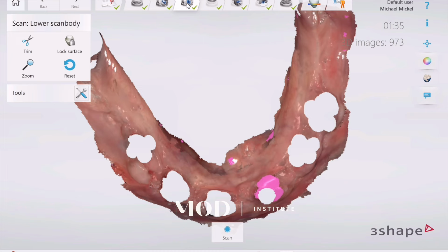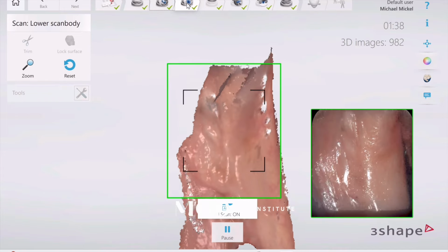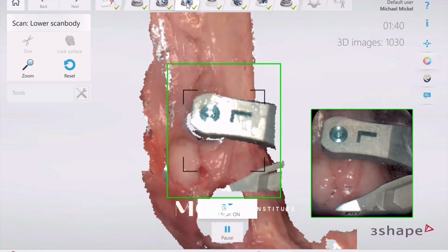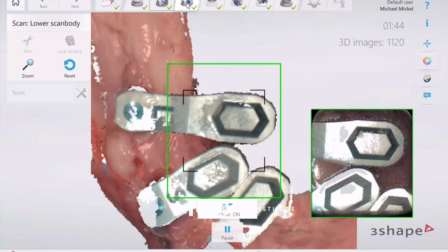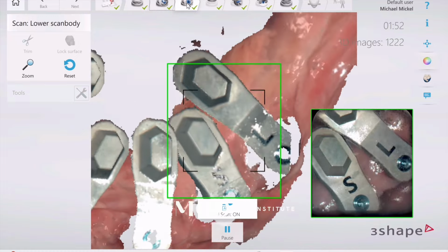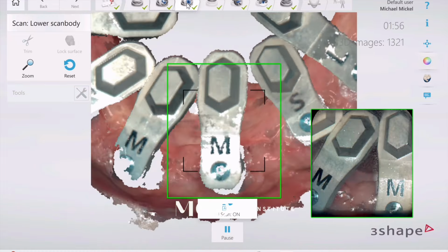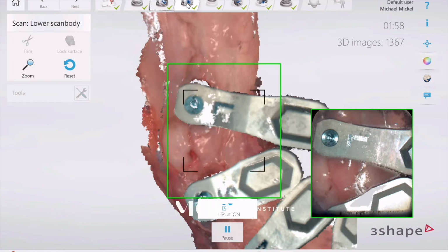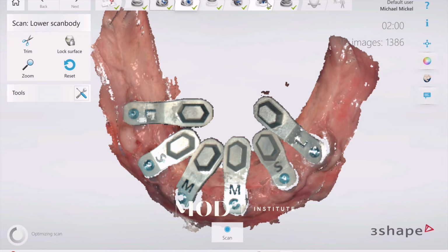And so that sometimes might necessitate you to actually start another scan window and not have it connected to anything. So I'm starting on the retromolar pad, and then I'm coming back to the hexagons and focusing on the hexagons, trying to get a few hexagons in the scan window at every given time. That's it. That's all you need. So I should have just stopped there, but I went ahead again because it's my first time using these. You do not actually need to scan where they connect to the tissue at all.